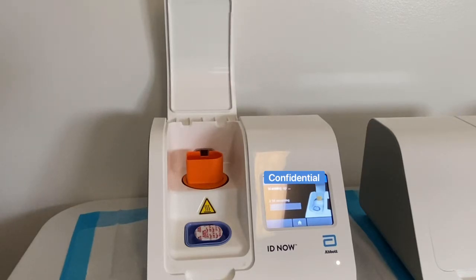Then it's gonna go ahead and warm up — it takes about three minutes to warm up. Make sure to follow the directions; it's really quite self-explanatory.